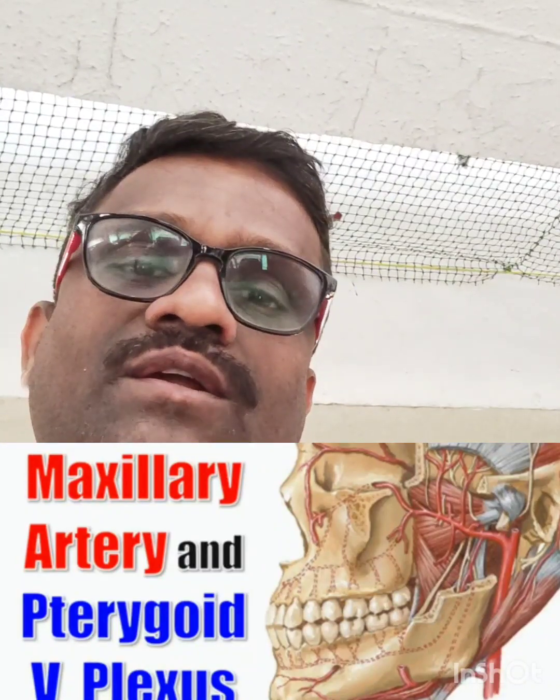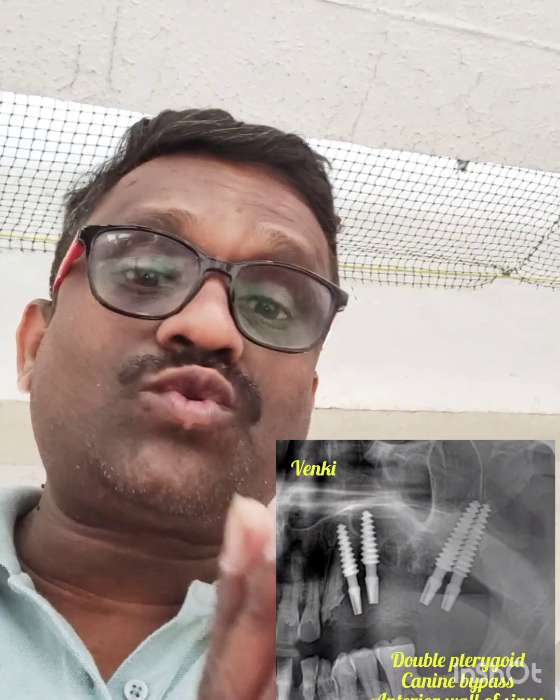So these are the anatomical considerations of the bony structures, taking into account the position of the maxillary artery. Angulation is very important while placing the pterygoid implant. You can start from the distal root of the second molar, angled 15 to 20 degrees towards the medial pterygoid. Don't ever place right into the lateral pterygoid, because exactly above the lateral pterygoid is your maxillary artery. So angulate towards the medial pterygoid. That is the area between the maxilla, the lateral pterygoid and the medial pterygoid, the pterygopalatine fossa area. You engage here, you will get good stability. Thank you.